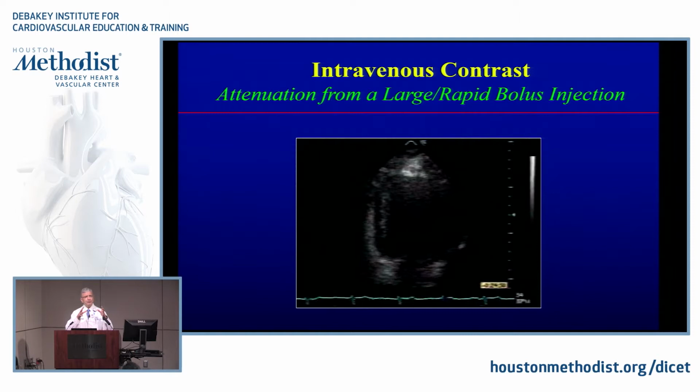If the concentration is too poor, I'm going to have some of these microbubbles in addition to black where you have blood. So your challenge, as a sonographer or a physician, is: am I dealing with a good concentration so my interpretation is good, okay? And if I don't see well, why not, right? Is it too much? Is it too little? Are my settings different? This is part of the learning curve today. And I know most of you have been exposed, so it's not a completely strange situation.